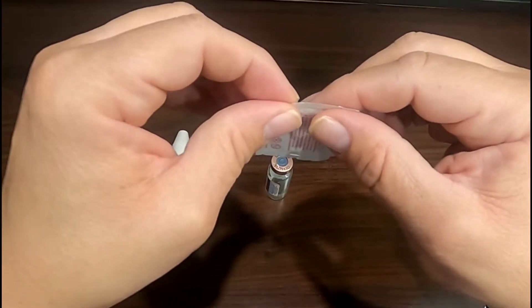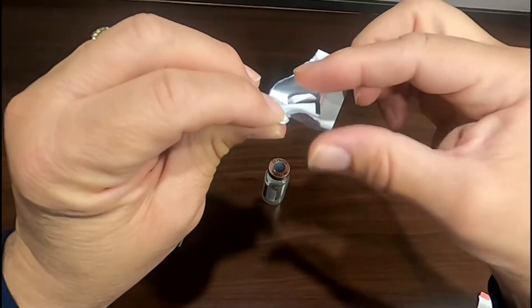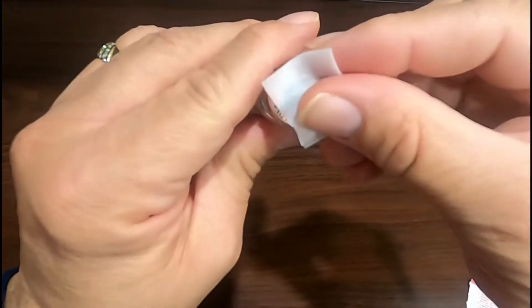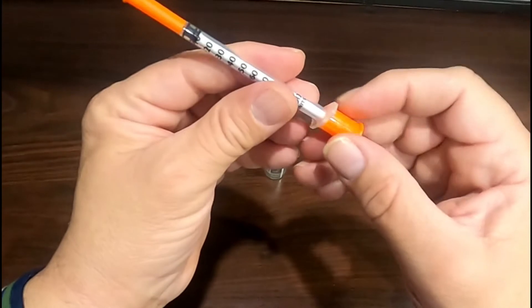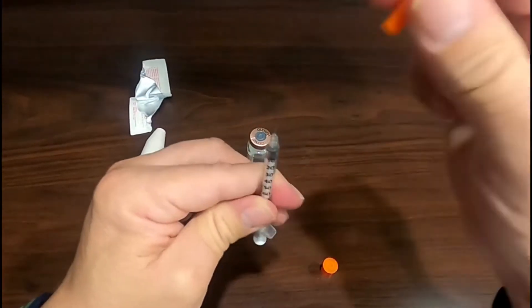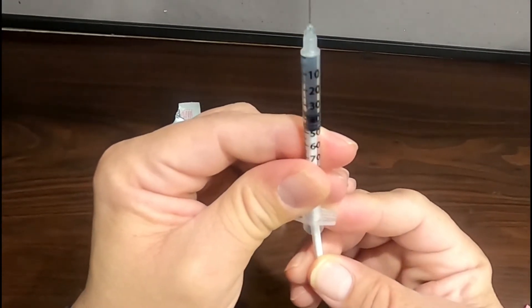Open a new alcohol wipe and sterilize the top of the rubber stopper on your medication vial. Set the alcohol wipe aside because you'll use it again in a moment. Remove both orange caps from the syringe and pull the plunger back to your prescription amount.